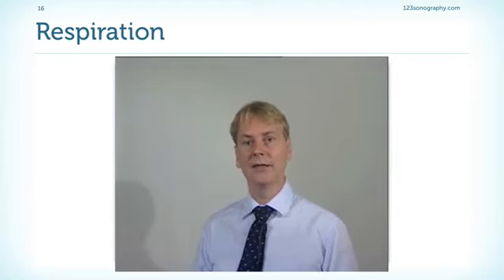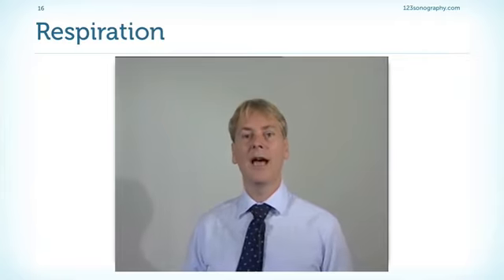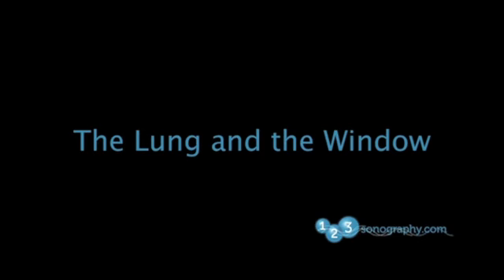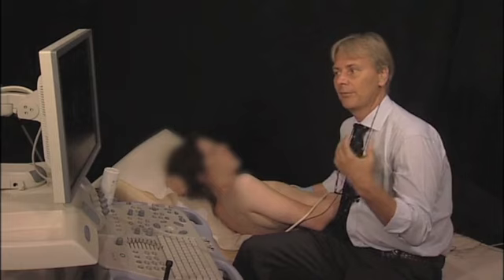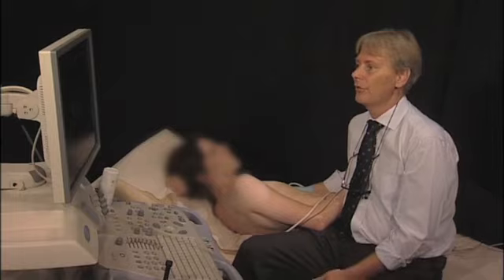We've already talked about the impact of air on image quality. So it's obviously a difference if the patient inhales or exhales. Let's take a look at what happens if the patient breathes. The lung has a very big impact on the quality of the images, simply because we cannot image through air, and if the patient inhales or exhales, we will change the windows and thereby change the quality of the echocardiogram.